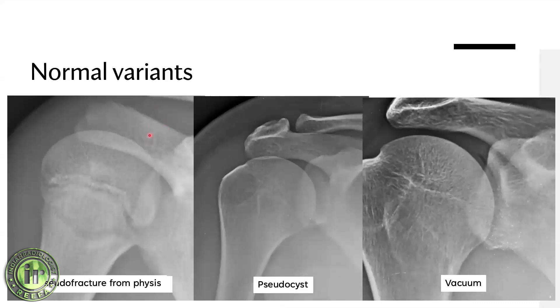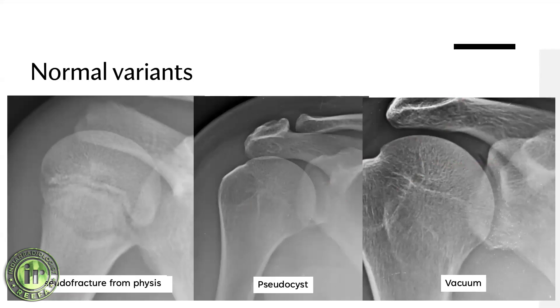There are several normal variants to be aware of. A line running through the proximal humeral shaft can easily be mistaken for a fracture - this is a proximal humeral pseudo-fracture due to obliquity of the physis. You may also see a cystic area in the humeral head - a pseudocyst - where the trabeculae just appear that way. Another subtle finding is sclerosis with subcortical cystic changes from rotator cuff enthesiopathy. You can also see linear gas shadows inside the joint - a vacuum phenomenon - which is normal and seen in the hip and shoulder.